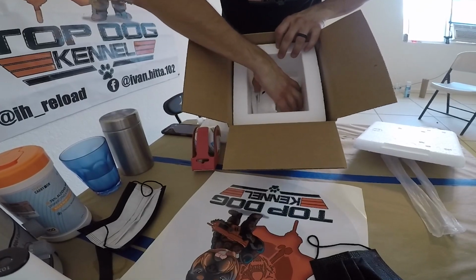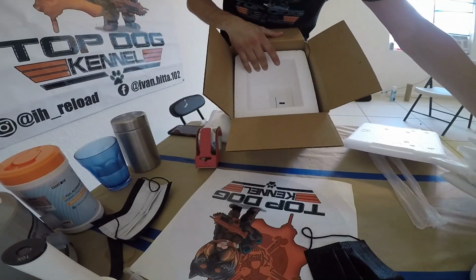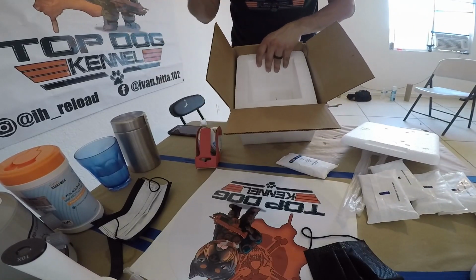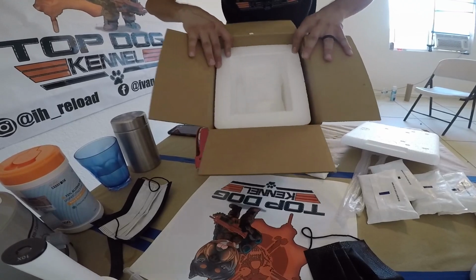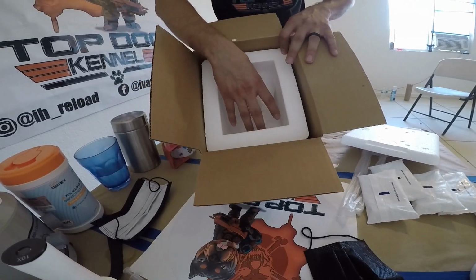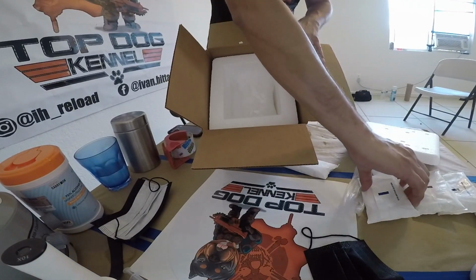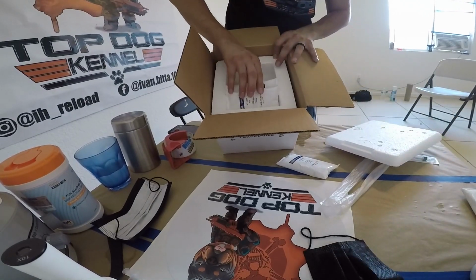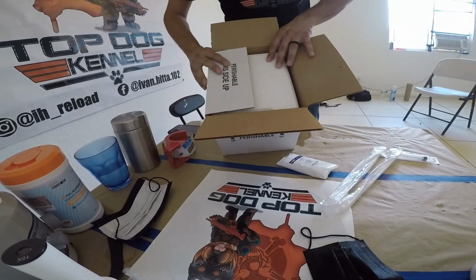And you wanna go ahead and take off the lid. Inside, we already got the ice that we're gonna go ahead and use. You don't need much of it. You need to keep it at a certain degree, but you don't need much of it. Now, what you want to do is put one ice down here, put your package in here. Now, you need to make sure it's a tight fit. That way, when it's getting moved around and thrashed around in the UPS box, in the UPS car or van, it's not getting damaged. It's nice and tight, and it's not gonna be rolling around and getting banged up. So you wanna put as much ice as you possibly can fit inside of your container. We use these small ones because it's the perfect size, and it also keeps the cost of shipping down.